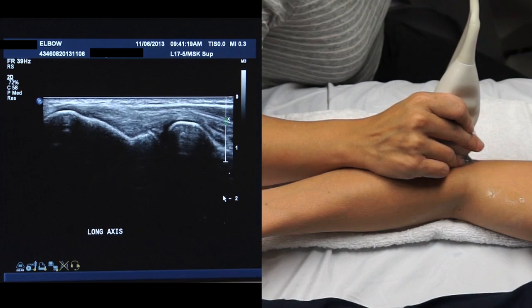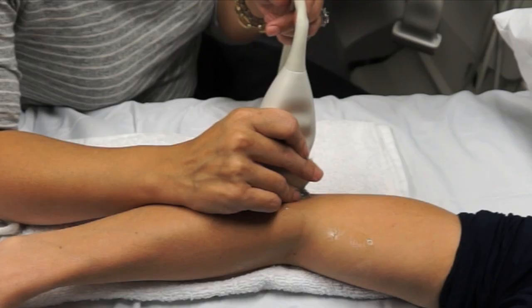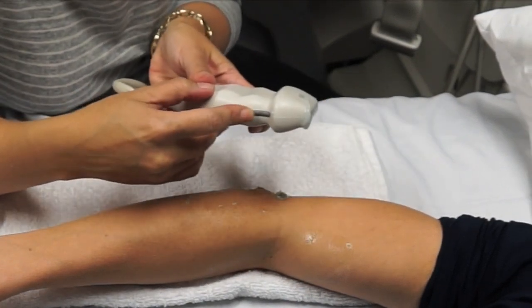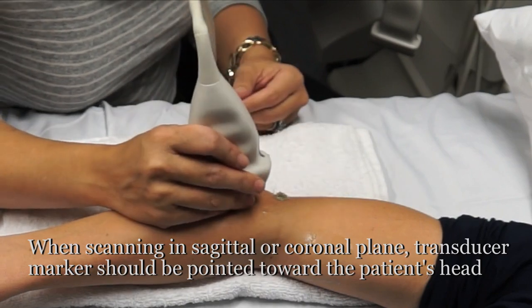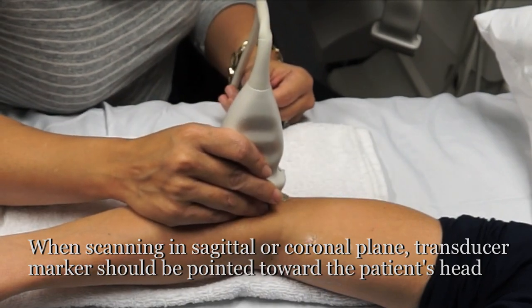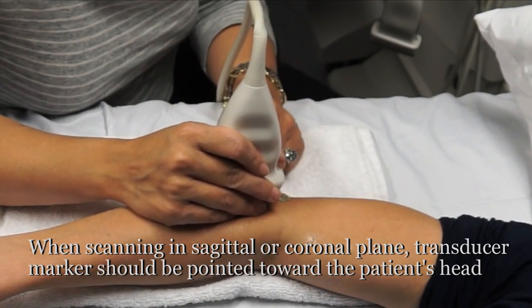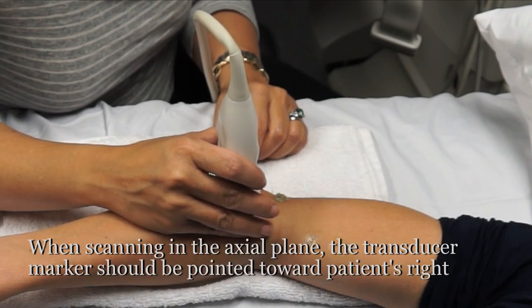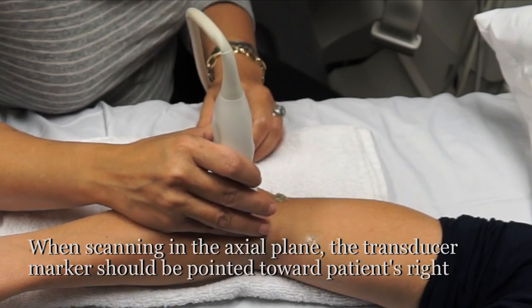Now, as for the screen orientation, most transducers have a marker. You can see the marker on this right here. And the marker should be oriented towards the patient's head or cranially in a 12 o'clock position or 90 degrees to the patient's right.